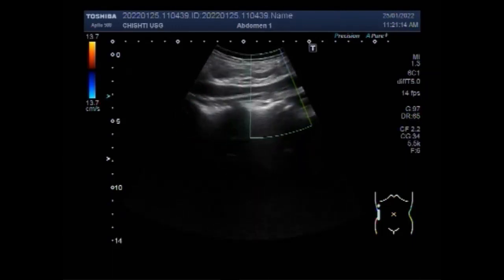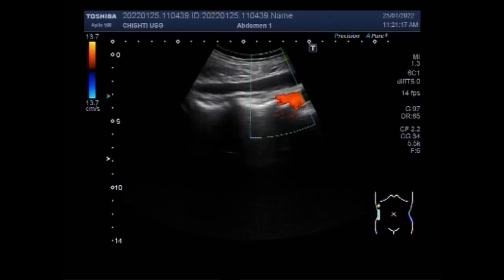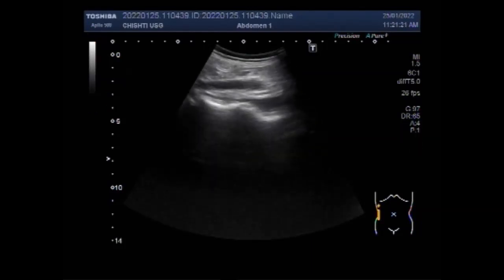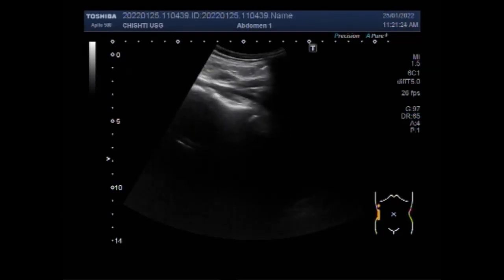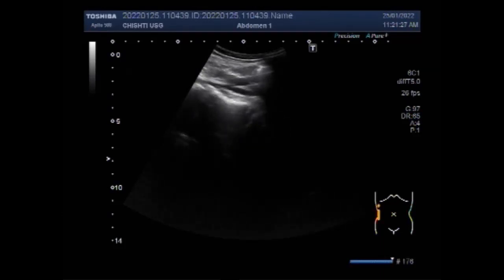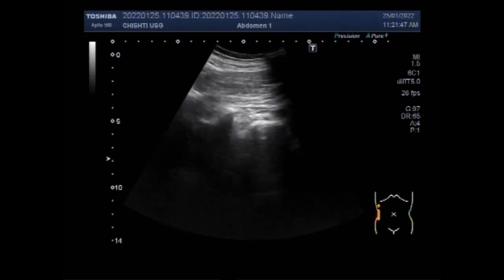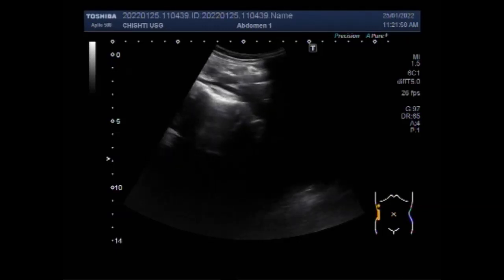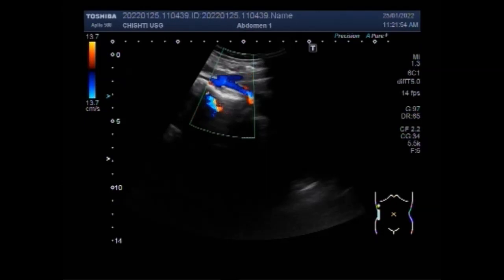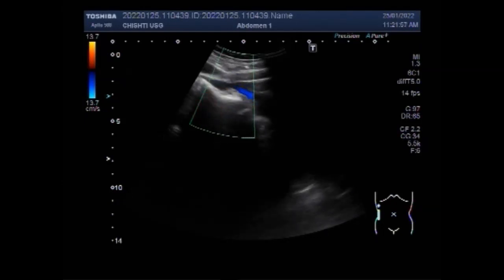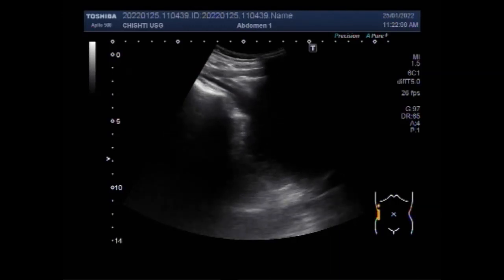Now you can see the tracing of the ureter. Here, as the ureter is crossing the iliac vessels, you can differentiate the ureter from the iliac vessels using Doppler flow. This is the right ureter and these are the iliac vessels. You can see the blood flow in the iliac vessels but not in the ureter.